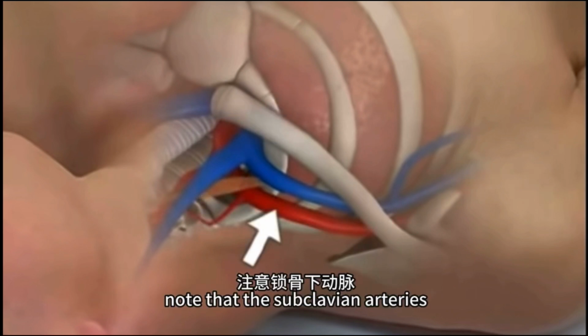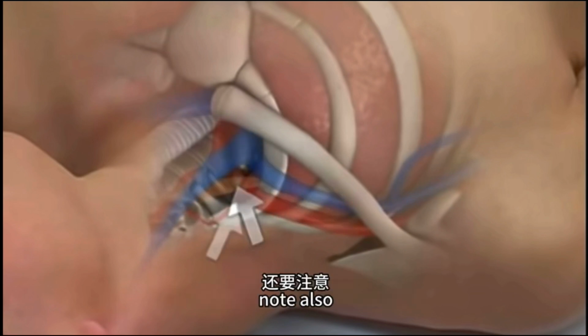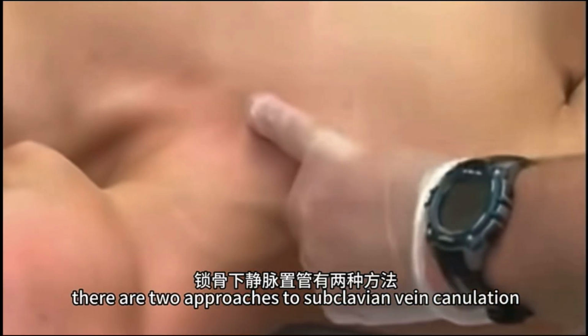Note that the subclavian arteries are located posterior to the veins and are separated from them by the anterior scalene muscles. Note also that the lung may extend to the level of the first rib. There are two approaches to subclavian vein cannulation.